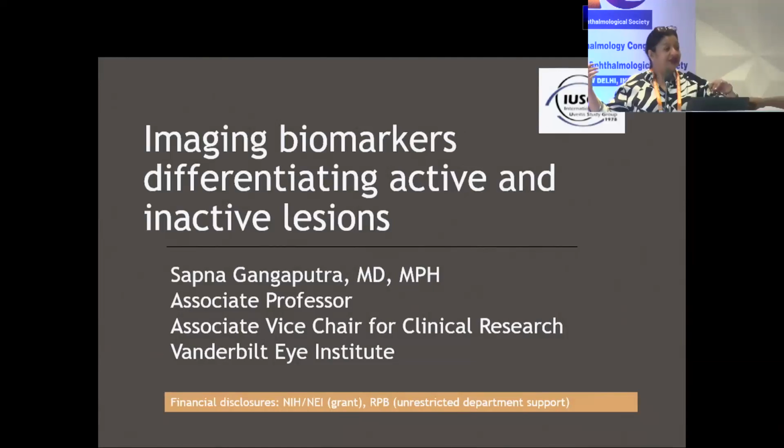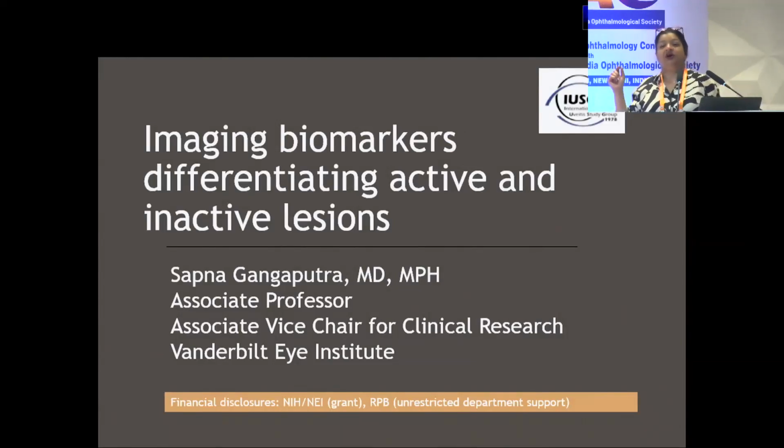What I'm going to be talking about builds up from what Dr. Thorne just said. We started with SUN 2, and really good clinical data about how we should define and classify diseases. But as she mentioned, the imaging part of that was reliant on what the physician said there was. They didn't do a deep dive into how imaging really helps consolidate this, how we really differentiate between active and inactive.